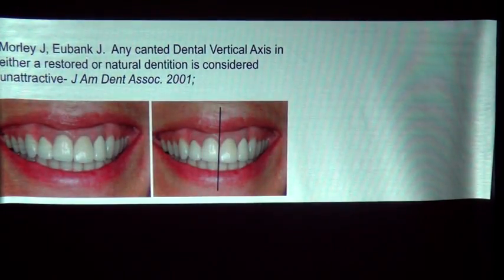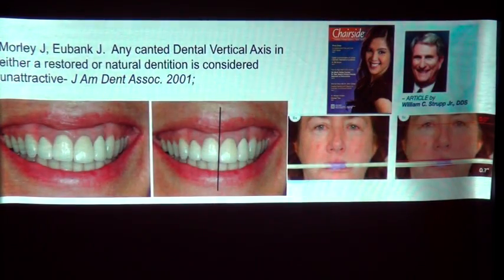And this is a similar thing with the bite stick that has many times replaced the Facebow. So we want to integrate our work, our function, as well as our aesthetic facial references. And we need to know where centric relation is.